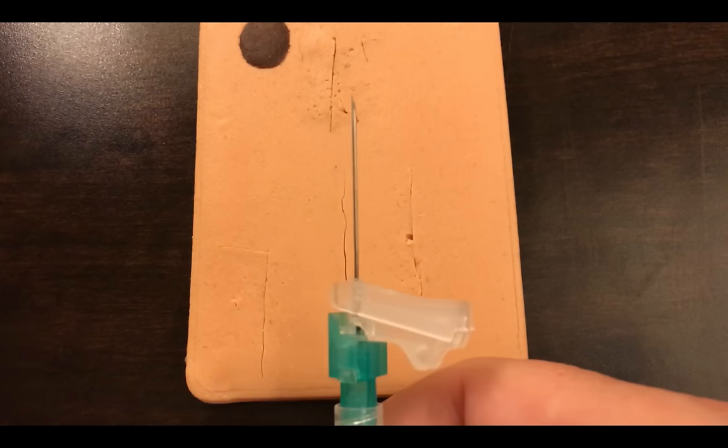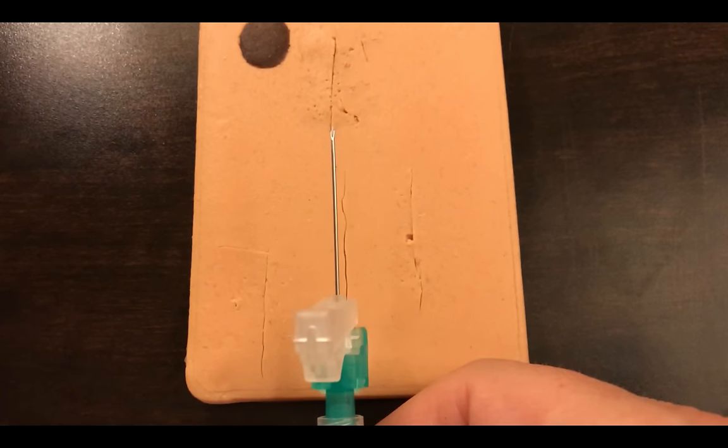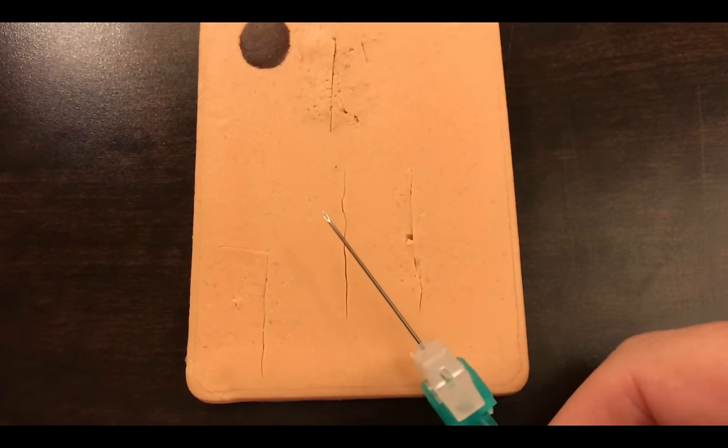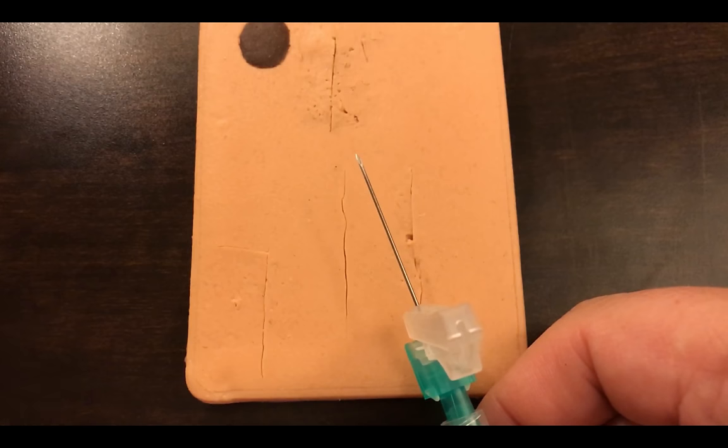For this video I'm using something larger — this is actually a 23 gauge, simply for the ease of visibility so you can see it a little better. Normally I'd use something much smaller than this.